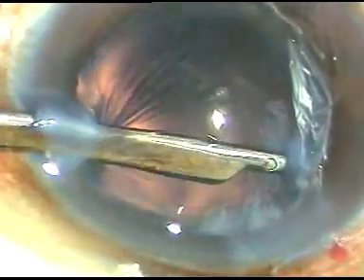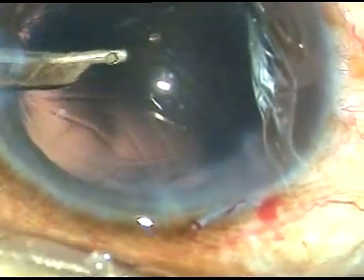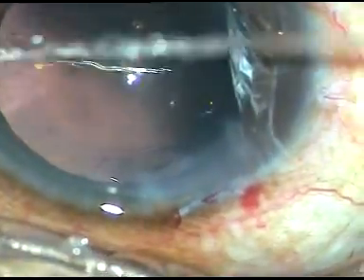So in intumescent cataracts, we can do rhexis with a very economic viscoelastic substance. There is no need of soft shell technique, no need of any cohesive viscoelastic substance like sodium hyaluronate, no need of Viscoat. We can just manage with HPMC. Yes, hydroxypropyl methyl cellulose, the most economic viscoelastic substance available throughout the world.